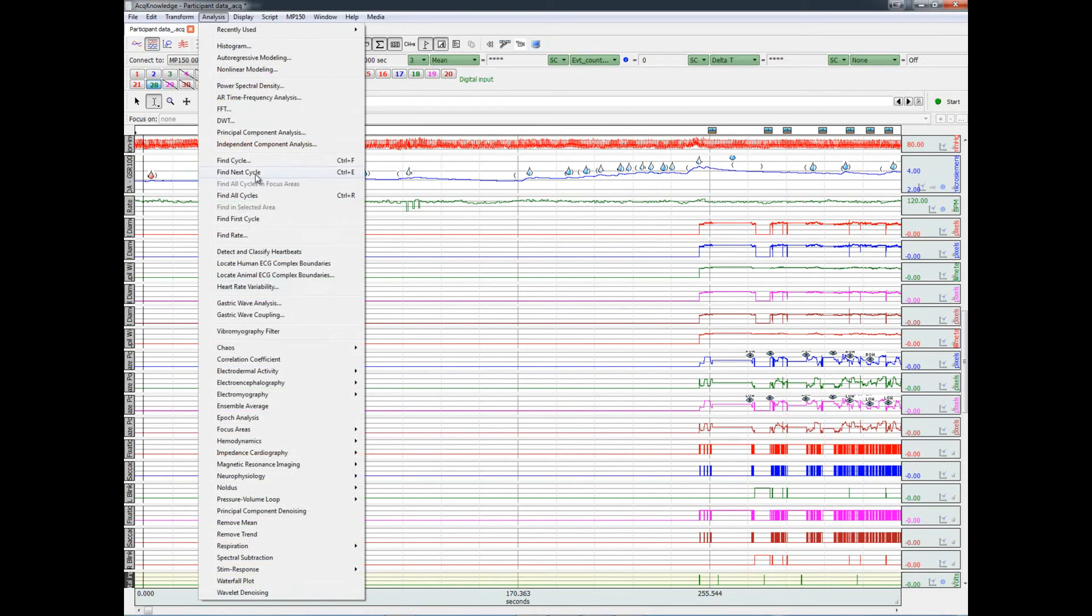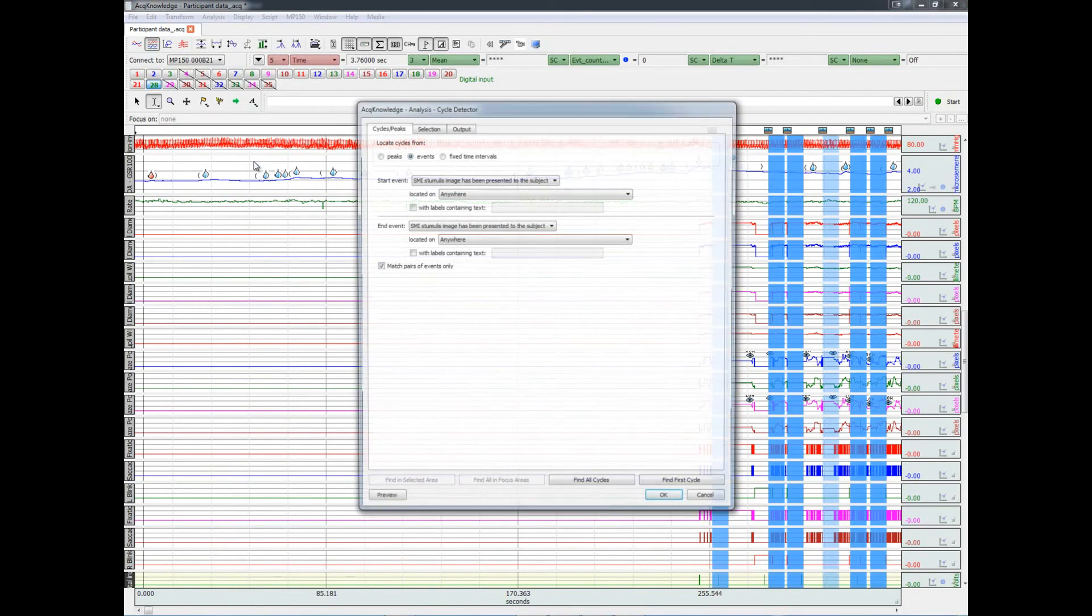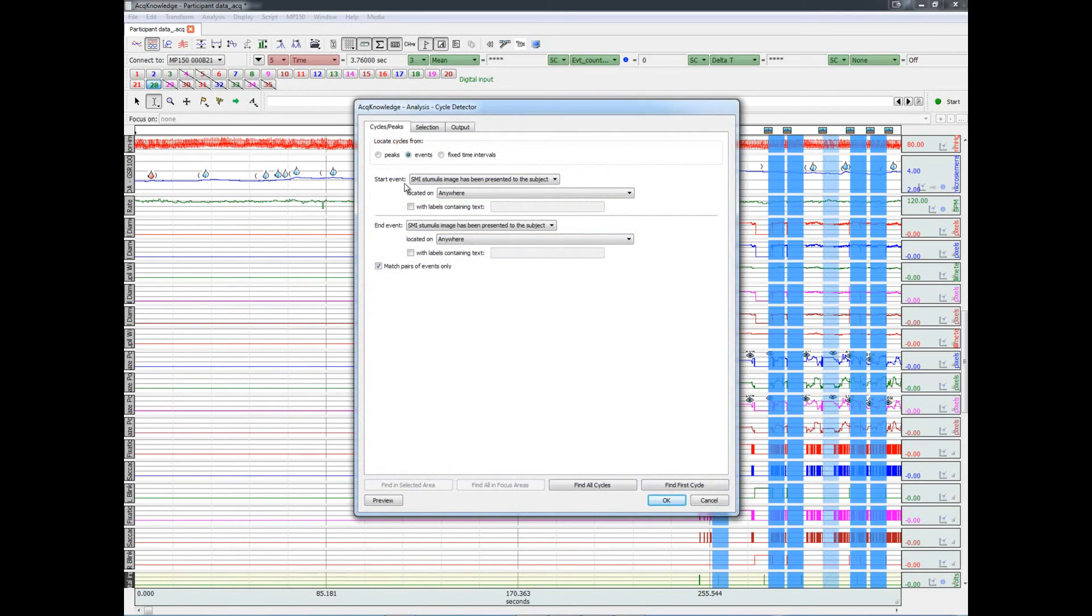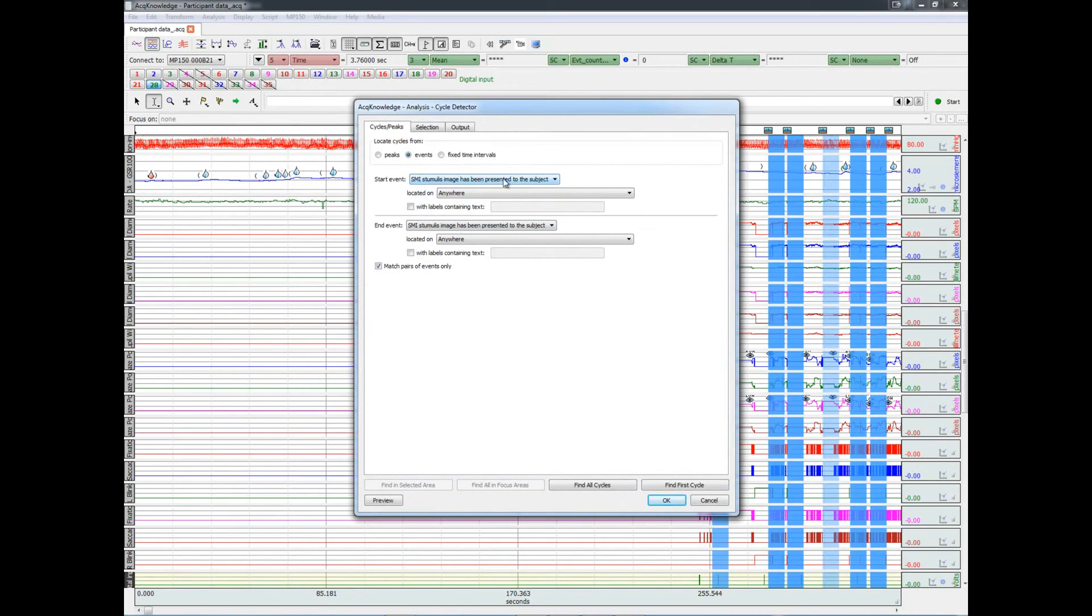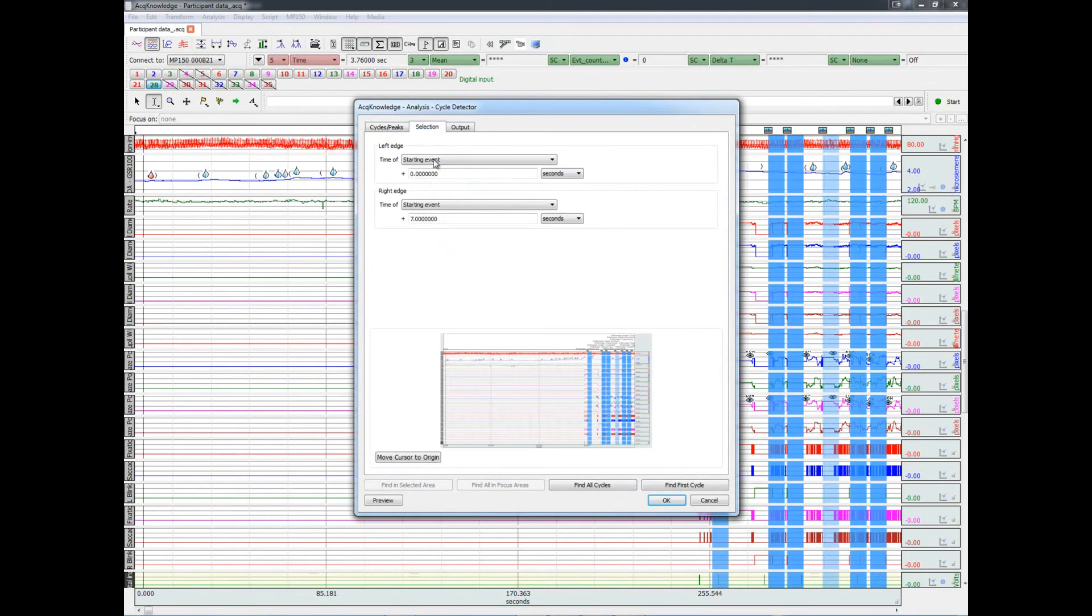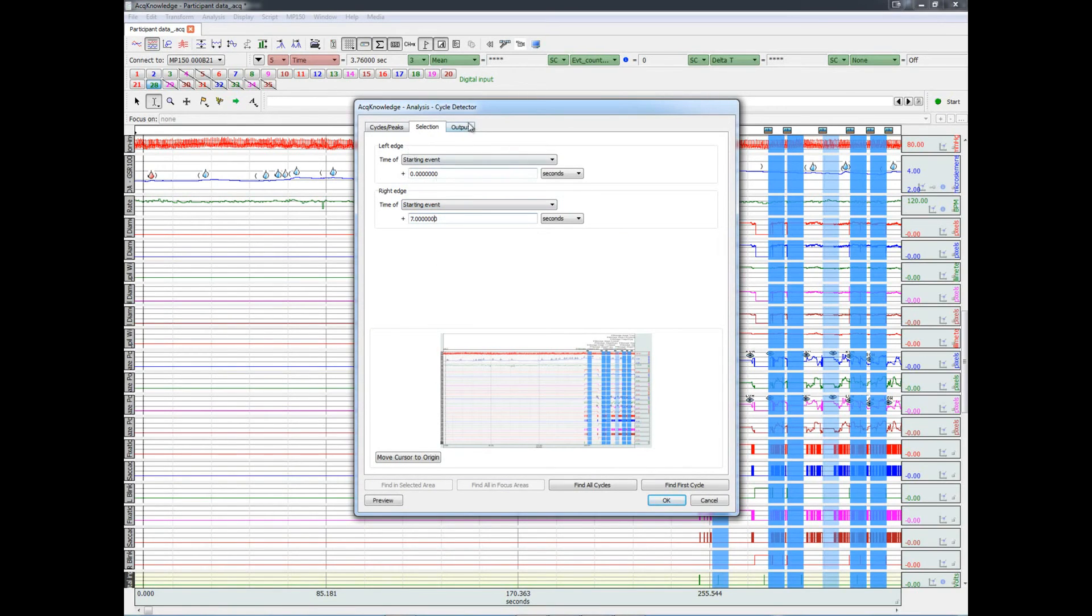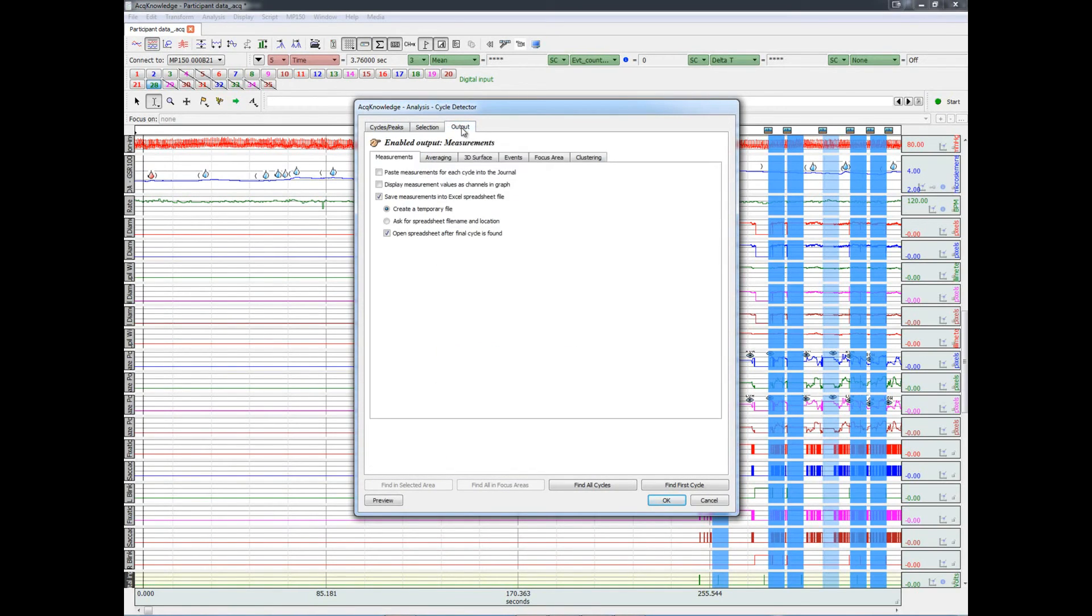We have to go to find cycle. Choose the start and end event. In this case, it would be the SMI stimulus presentations. And then we'll highlight from zero to seven seconds after the beginning of the stimulus presentation. And we'll output the results in Excel.